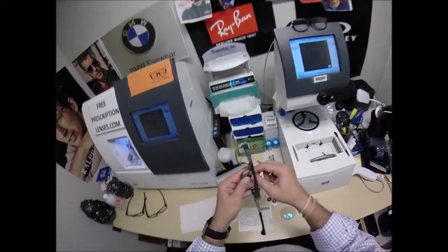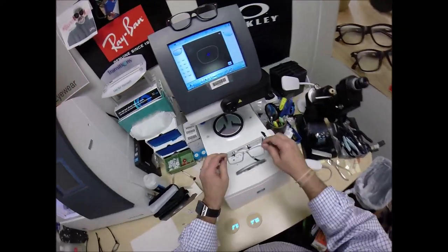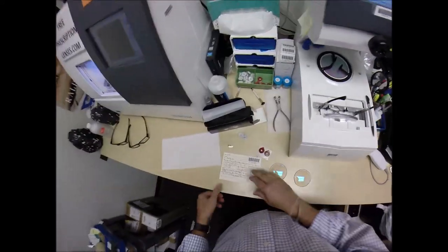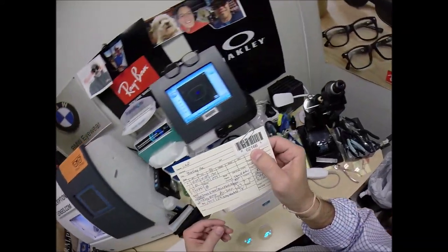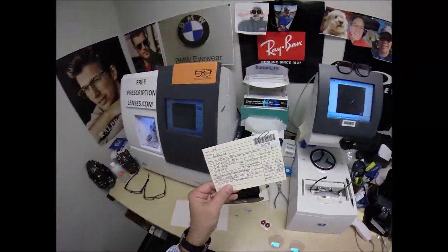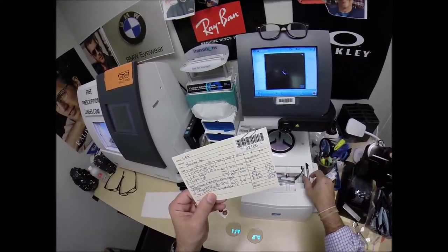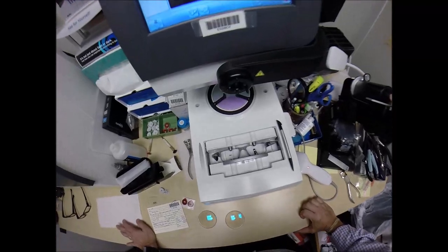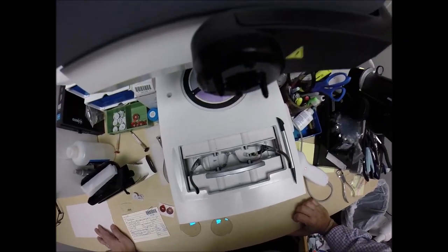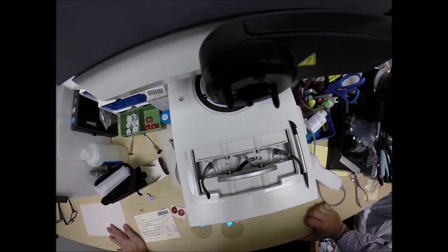But first, I want to pop out your original demo lenses. Put your frame into the tracing element of my blocker. Program this shape into the computer. You are Secret Agent 2166. So years from now, should you ever need new lenses for this frame, I can mail them right to your home. You are also volume 2,166 of my 327 million volume series of cutting a pair of glasses for everyone in America.